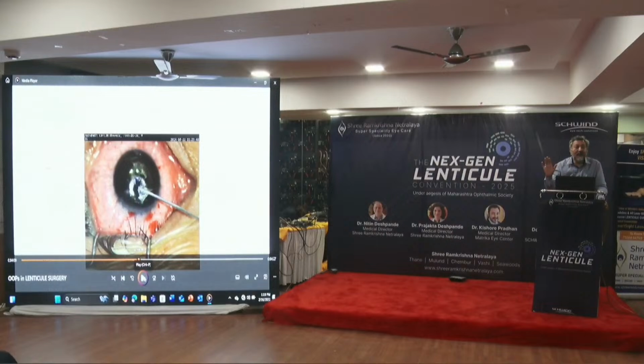But this is a 40-minute video. You can attach a retina in 40 minutes, but the surgeon has done 50,000 LASIK. And then doing a lenticule, he never thought it would be so bad. He went on and on and on. So the thing is, you think you're on a different plane, and you want to find the other plane, and you can't find it. That means you're already in that plane, so you've got to look for the other plane.